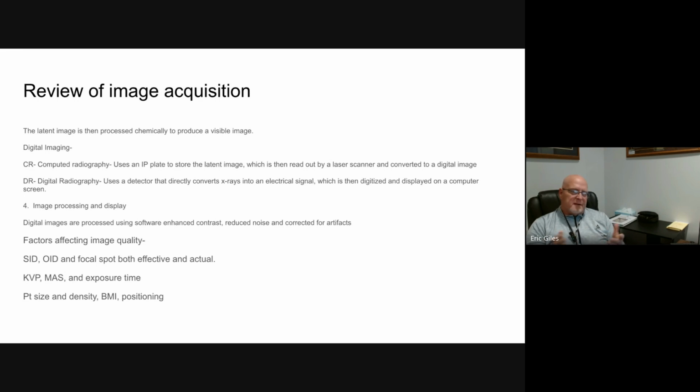And that's awesome. You know, we don't have to do a lot of post-processing on our images, just because our techniques are set up in the computer really well. So unless you've got a bigger patient, and then you'll have to make some adjustments. But we've got it pretty good, pretty awesome.